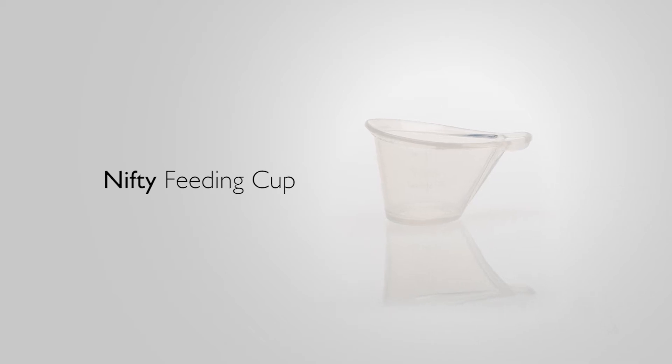The Nifty Cup is a reusable cup for feeding breast milk to newborns with breastfeeding difficulties.